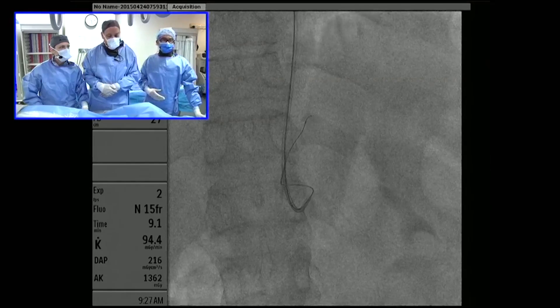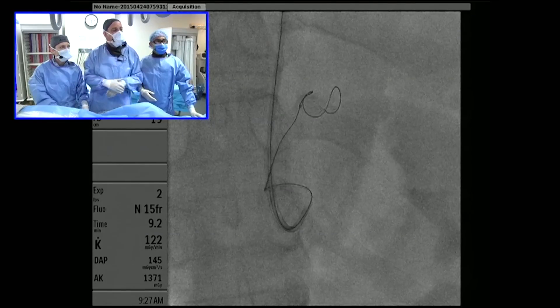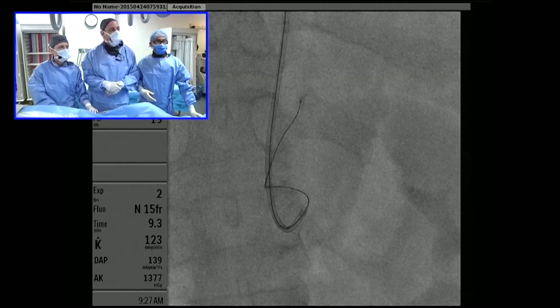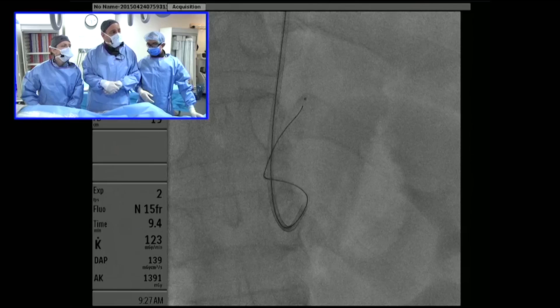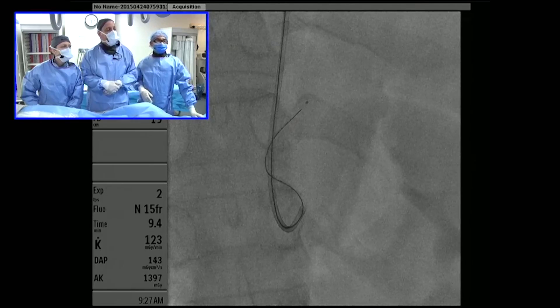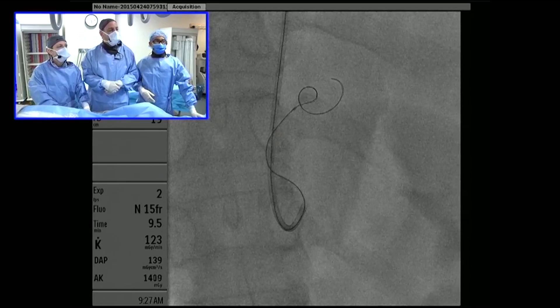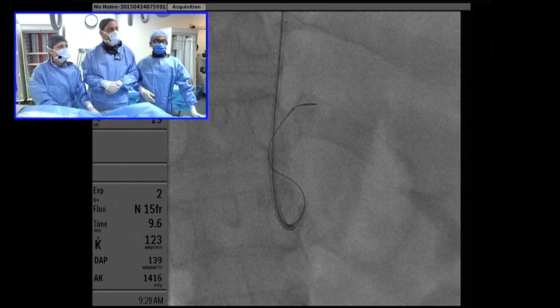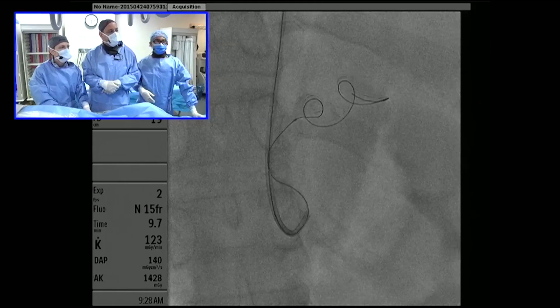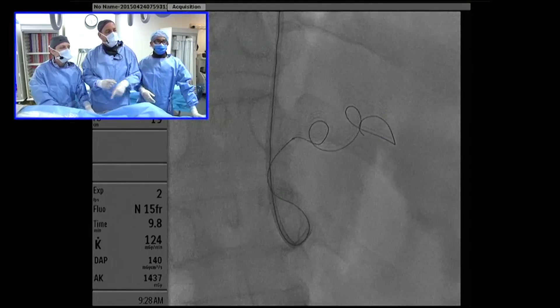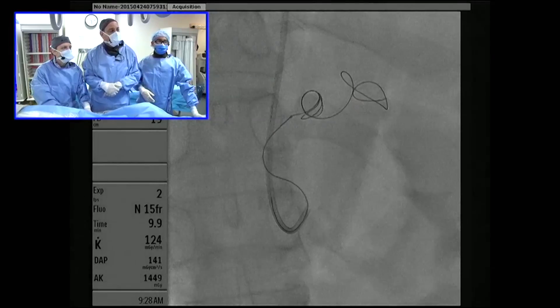We really want to make sure that this thing doesn't fly out — we want to make sure it stays still. The amazing thing about this technology is that if we don't like the way it's sitting, we can reposition it and play with it to try and get it to stay still. Very frequently with these coils it takes half a dozen or so deployments to get it to sit in the right location. Typically, right at that turning point, it'll double over and hopefully lock in.